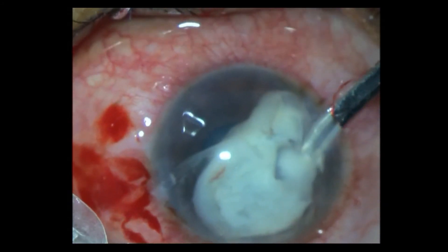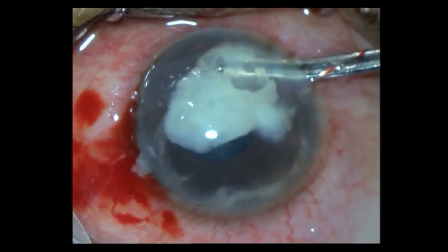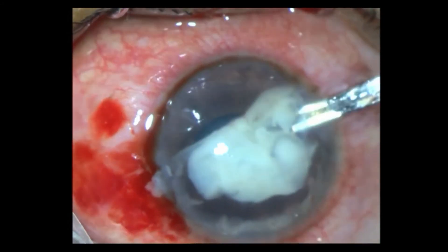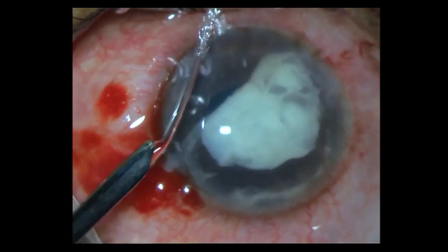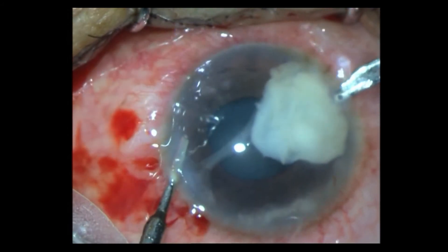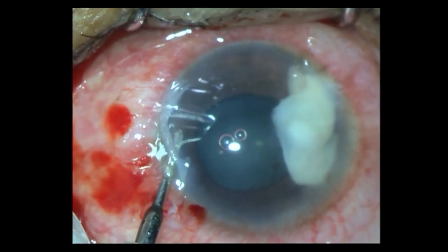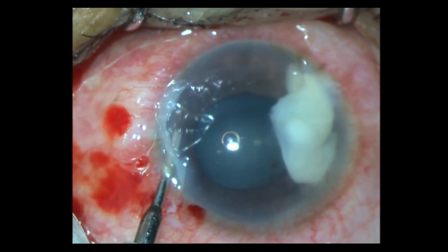The idea is to bring out all these membranes. Finally I put in the anterior chamber maintainer from the other side and then try to evacuate it with the Simcoe again. I have partially evacuated some, and the rest you can always engage with the forceps, which I will show subsequently.